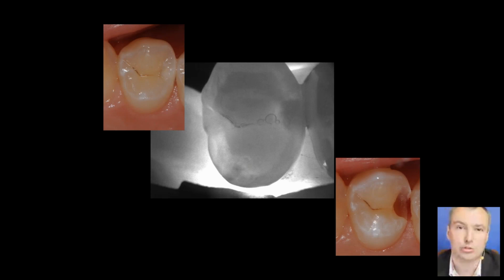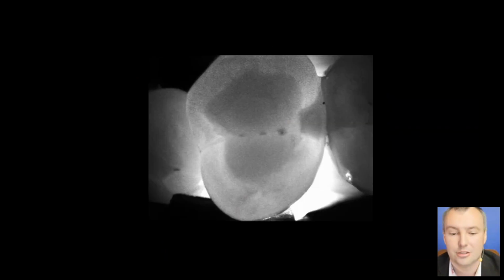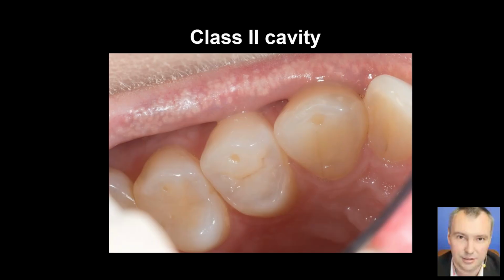So from the tooth that looks quite okay, and remember that also for the patient, this tooth looks quite okay. Even if we show him the image with the intraoral camera, it looks okay. There is no caries. And yet there is, and we know how to find it. Another case, maybe more obvious, again, if the tooth is large. So this is actually quite a large cavity, a little bit visible, also opened, also with a typical, almost from the book, look of the carious tissue, cleaned and filled.